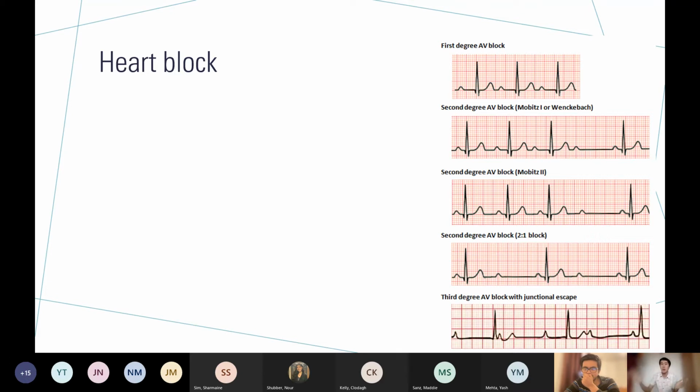And because it's sort of coming, you almost expect it. Whereas with our Mobitz type 2, they come on time on Monday. They come on time on Tuesday. They come on time on Wednesday. And then Thursday, they're not there. Then you're like, oh, what's happened with them? You know, are they okay? And that's why you need to put a pacemaker in them.